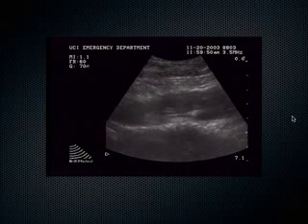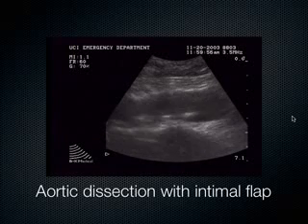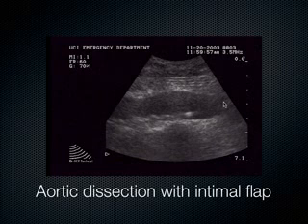Someone said it already. It's a dissection. So this is an aortic dissection, and that's an intimal flap that you see going along there. If the intimal flap separates away from the rest of the wall of the aorta, blood can come right down in between this intimal flap and the outside wall and push this intimal flap even more anteriorly, and eventually you can occlude the flow of blood down the aorta. And that's an aortic dissection. Different than an aneurysm, right? The aneurysm was that giant structure. The dissection is this flap that comes off.